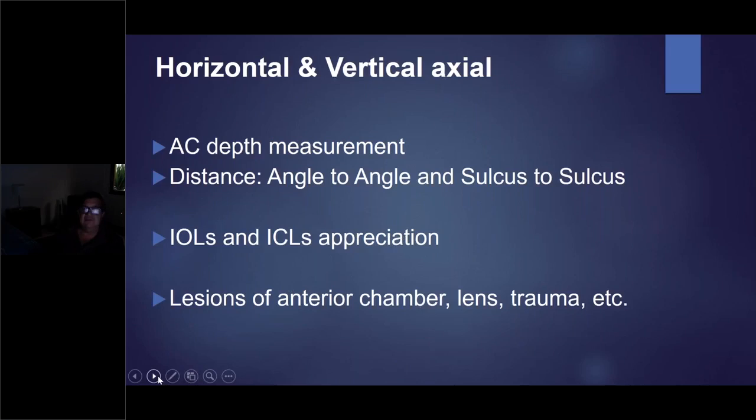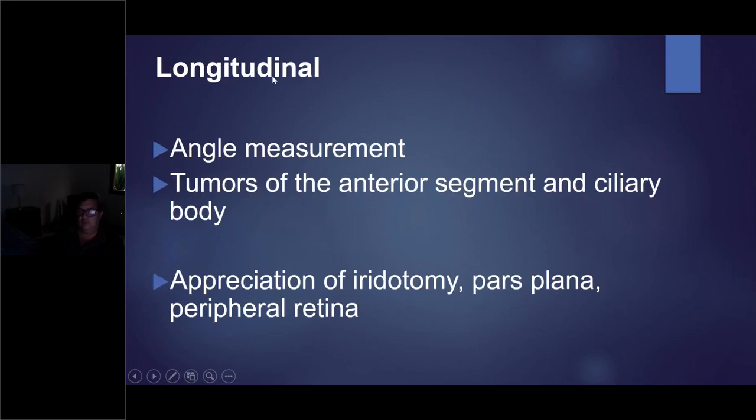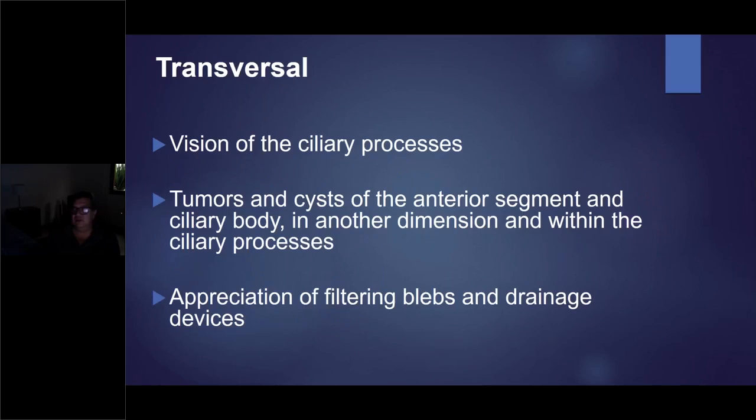Longitudinal, as you have seen, is more important for angle measurements, tumor of the anterior segment, ciliary body, appreciation of iridotomy, pars plana, and even peripheral retina. Transversal is very nice to see the ciliary process in another way. Tumors and cysts of the anterior segment, ciliary body, and within the ciliary process. We will see the images.